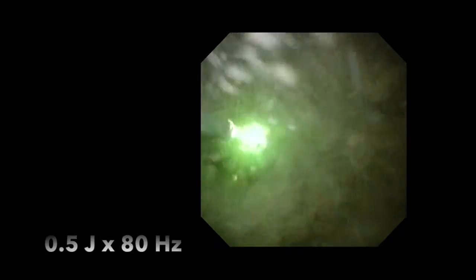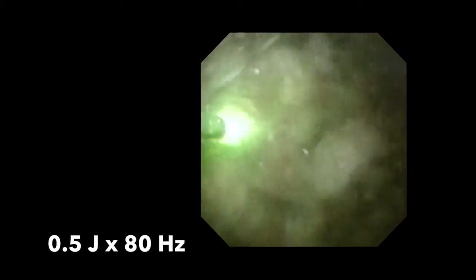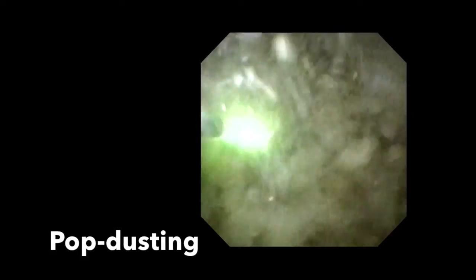The settings for dusting depend on the hardness of the stone. With the 120-watt system, rates of up to 80 hertz are possible for very high-frequency dusting. Towards the end of the procedure, we increase the energy to 0.5 joules times 80 hertz, similar to a popcorning methodology but utilizing lower-pulse energy and very high frequencies. We have found this results in very fine fragments, and we call this hybrid between dusting and popcorning, popdusting.